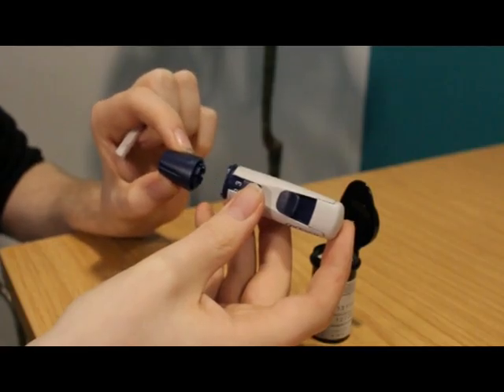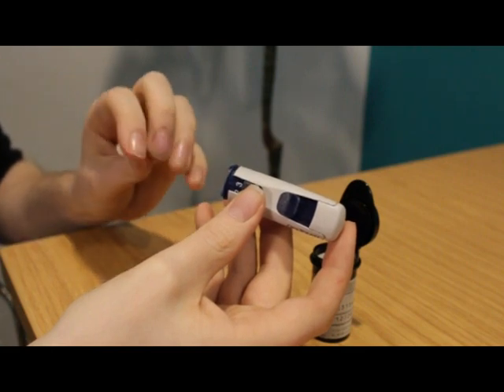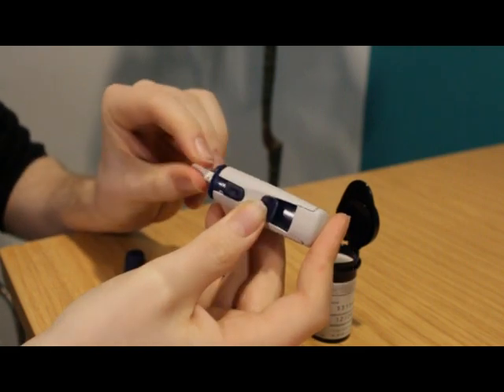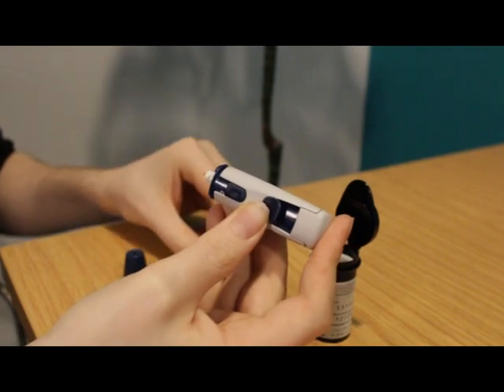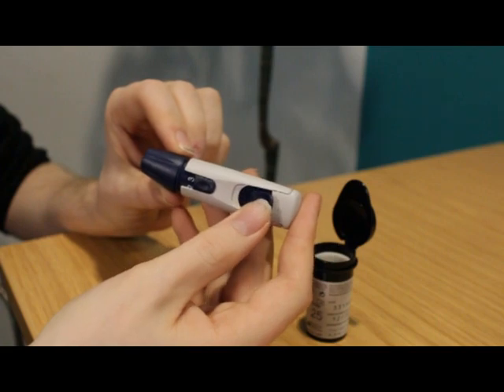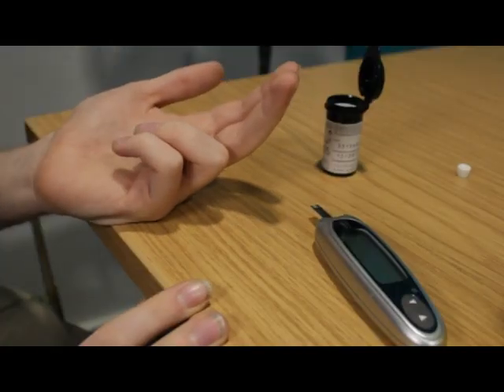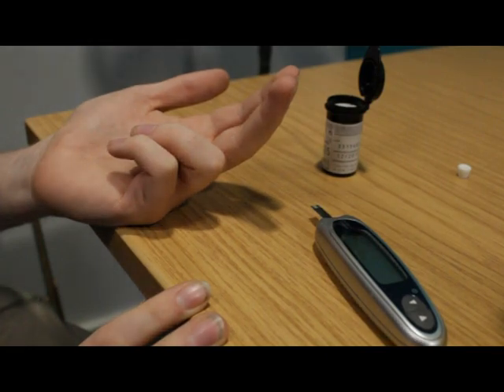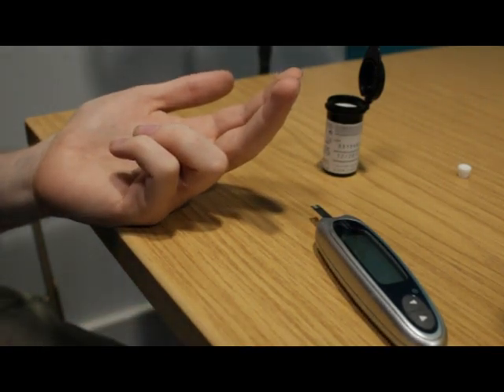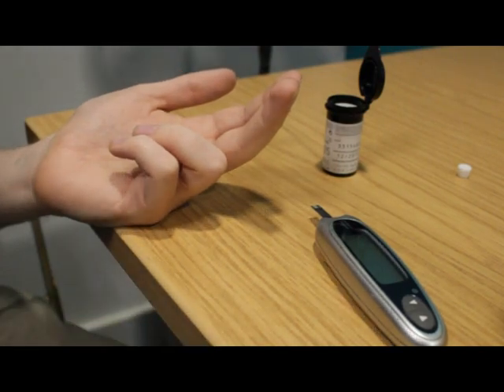Remove the end cap from the lancing device. Insert a new lancet into the lancet holder, twist off the protective cap, and replace the end cap. Set the lancing device. Choose which finger you're going to prick — the sides of the end segment of the finger are best. Don't prick the pad or too close to the nail.